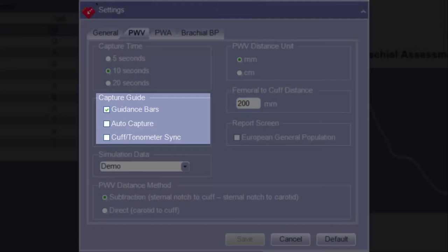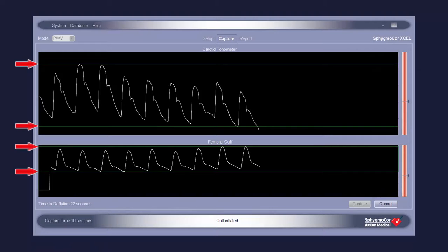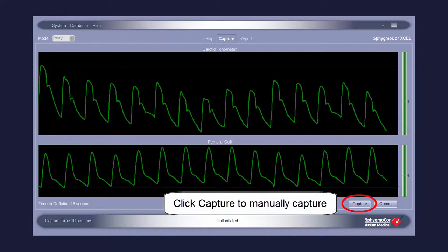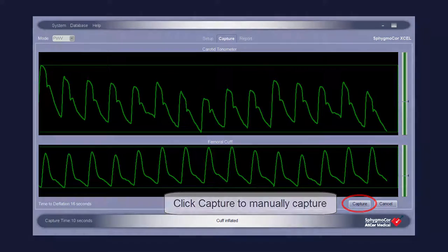Under Capture Guide, the Guidance Bars, Auto Capture, and Cuff Tonometer Sync options can all be disabled or enabled. Guidance Bars provide visual feedback on screen during data capture that inform the operator about the consistency of the waveforms. Auto Capture allows the software to automatically capture waveform data once waveforms of sufficient quality and duration are present. Even when Auto Capture is enabled, waveforms can still be manually captured.